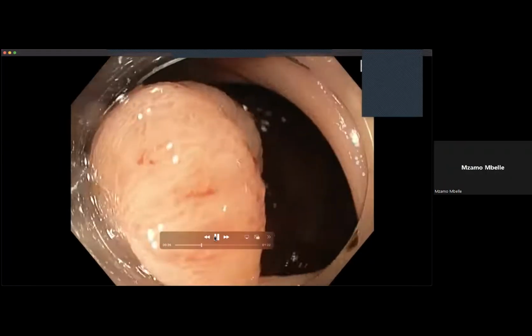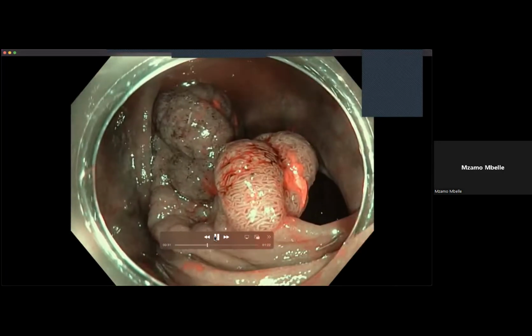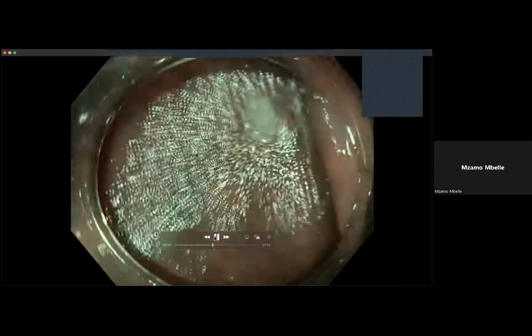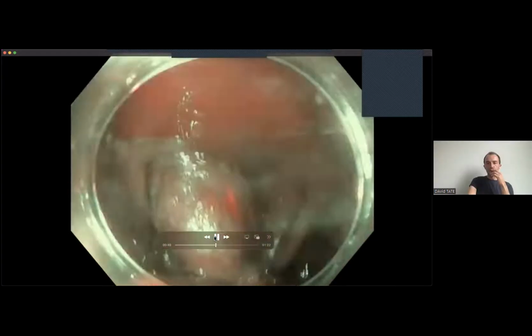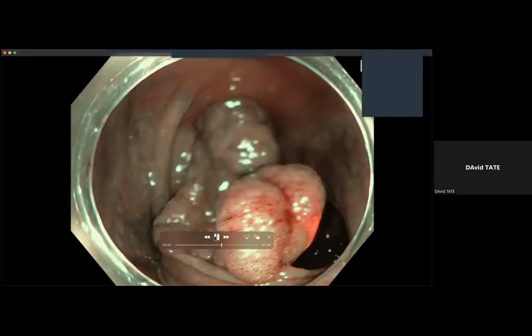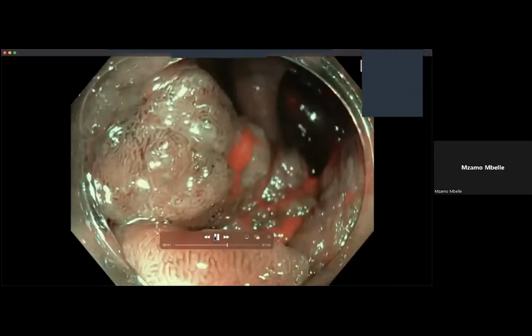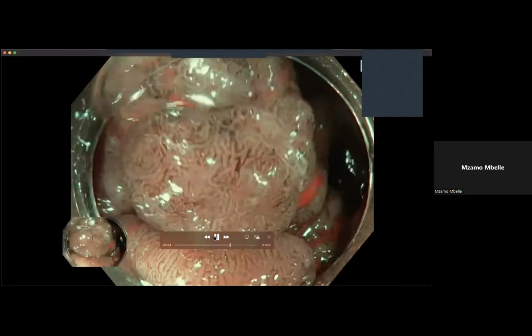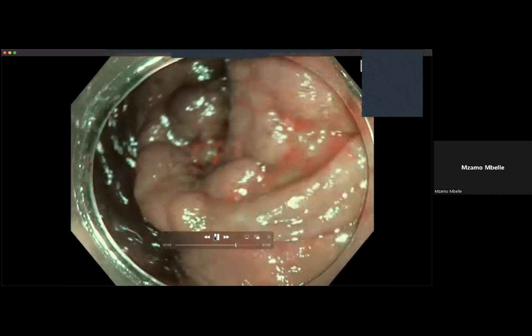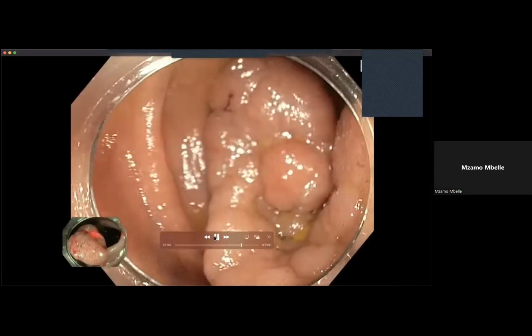Looking at the most of the polyp, looking for that demarcated area, I don't see one jumping out at me. I agree with that. And then just to classify the polyp, it is quite a large polyp, certainly more than 3 centimeters, maybe more. I would classify it as a 2A lesion. I'm not quite sure if there's an area of depression within the center. I think it might just be related to the granularity rather than an actual depression.